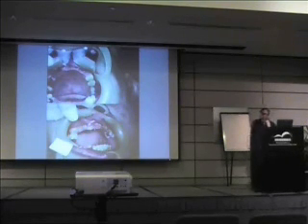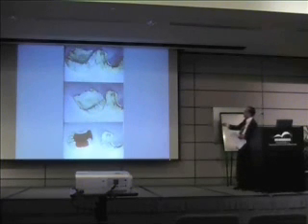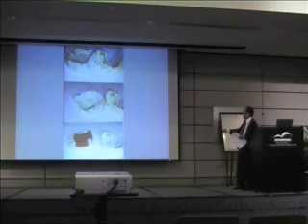Okay? And that's how the interior looks like. Healed up very well, no problems. For the denture to be done, you take an impression, build up this area with a block of stone, send it to the lab and ask them to make it. And of course you take a bite and all that. You make a bite block on this one.